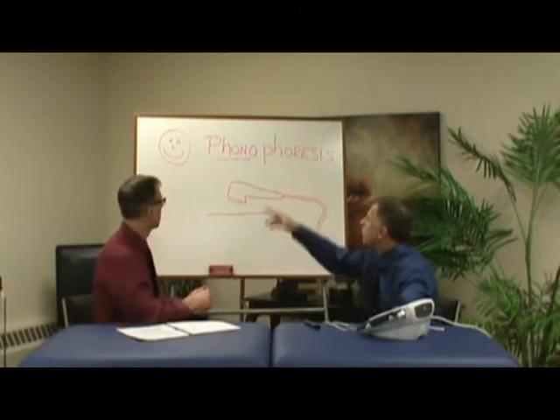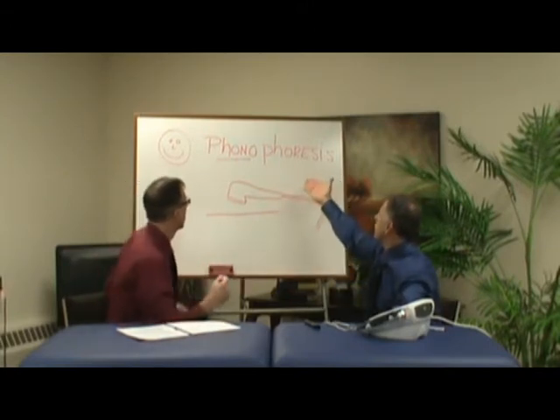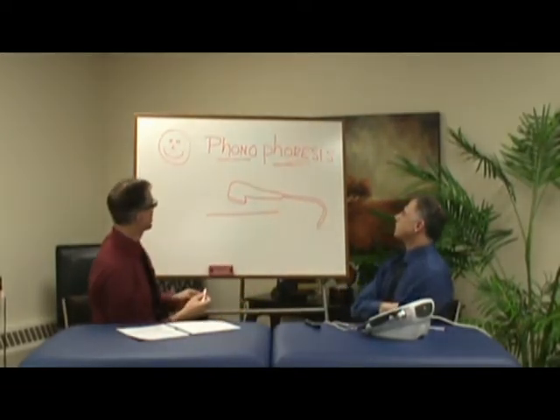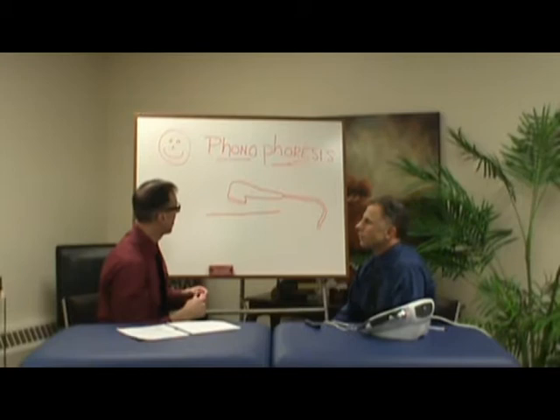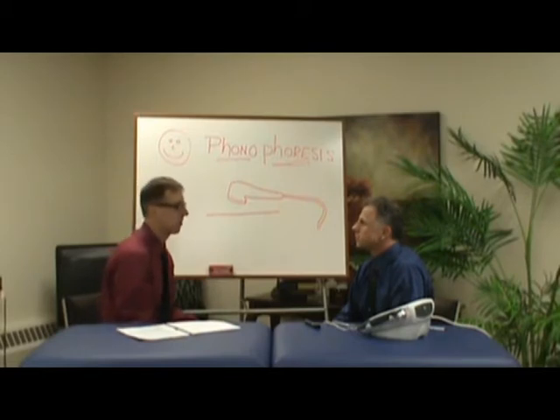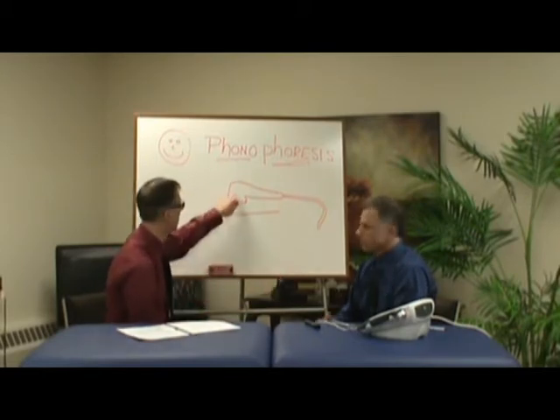Right. So we know what phono is, and what about this phoresis? Phoresis means transmission, so what we're trying to do is transmit normal topical medication through the skin deep down into the tissues. So we're going to use this machine to do that, and this is a simulation of the ultrasound head.